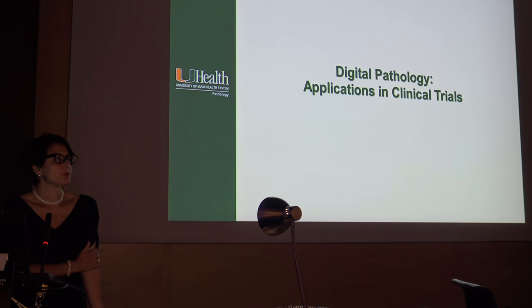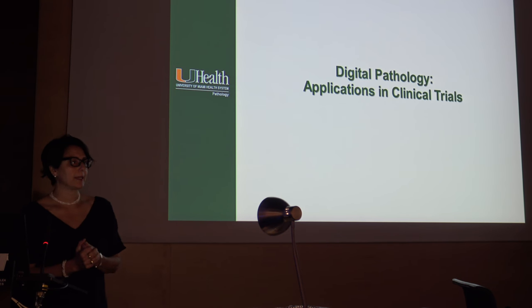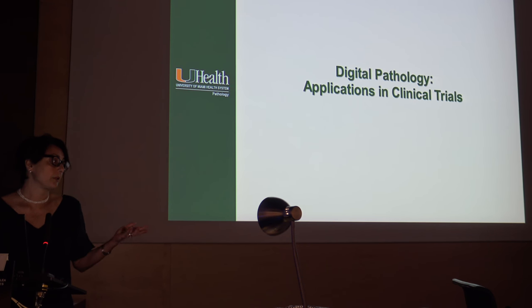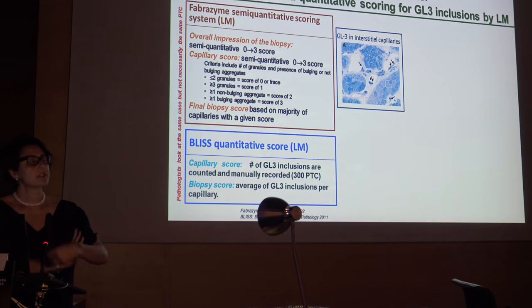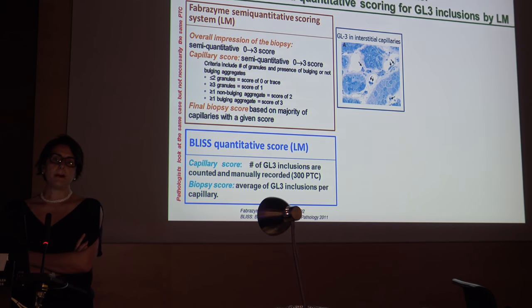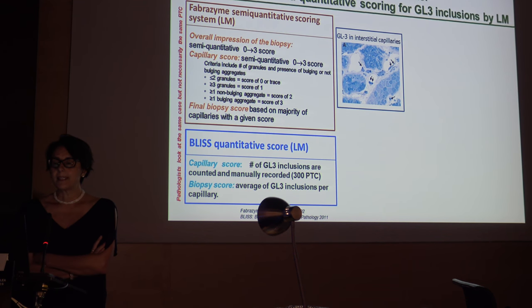Application of digital pathology was really initiated by clinical trials, not by the clinical setting. And this was the case, and now it is actually the standard of what we do for clinical trials. The first clinical trial that used digital pathology was a trial on Fabry disease. But if we look at it historically, the very first trial by Genzyme utilized conventional light microscopy.